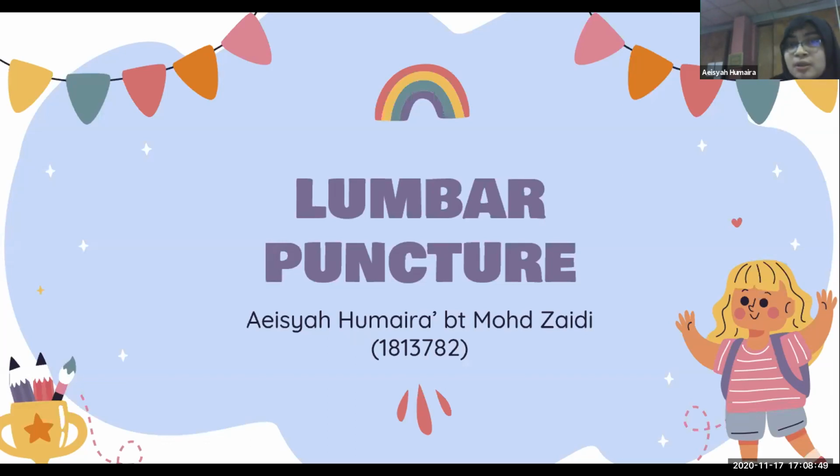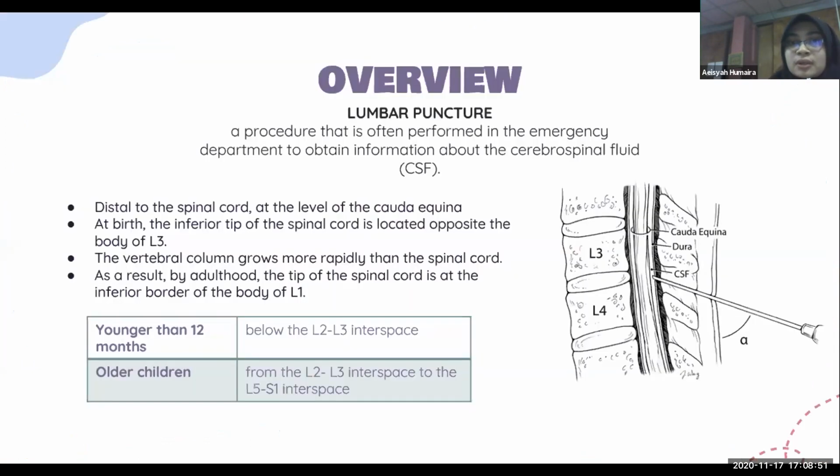Firstly, the overview of lumbar puncture. Lumbar puncture is a procedure often performed in the emergency department to obtain cerebrospinal fluid.